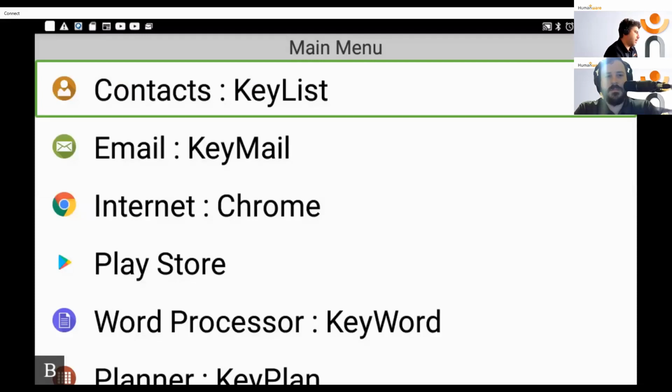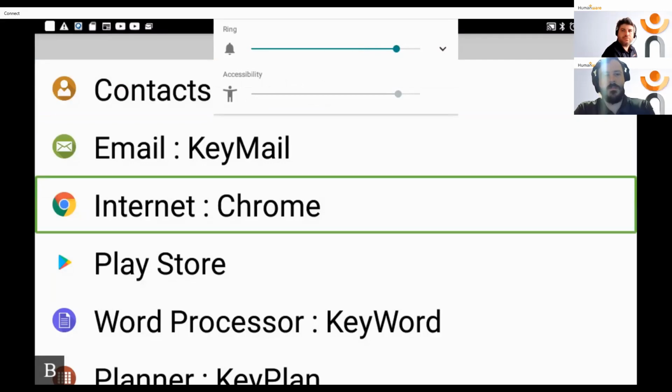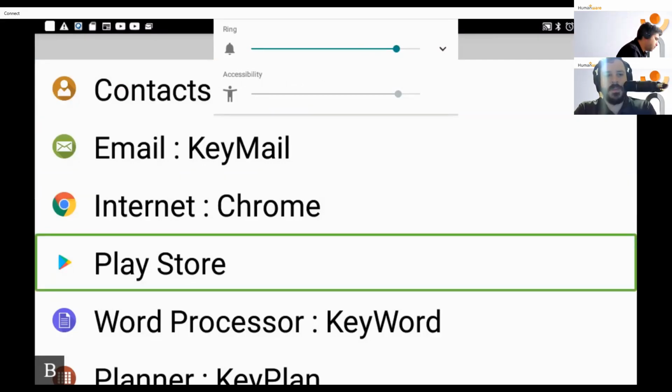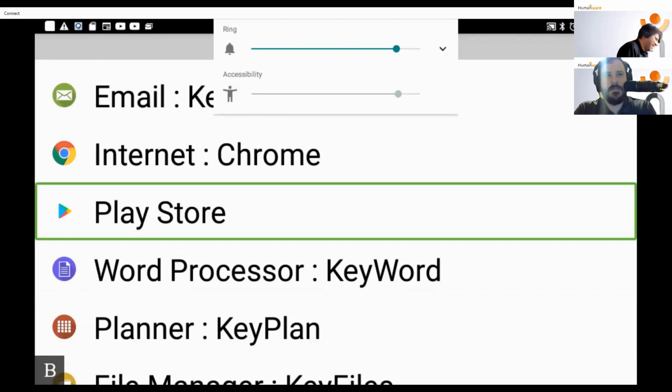I'm on the main menu, sharing the screen. Just confirm, is the volume coming across over there, Peter, or not? Absolutely, you're good. It's coming across, yeah? Yep. Oh, yeah. Okay, I can't hear it, that's all. I hear it loud and clear. Strange that I can't.